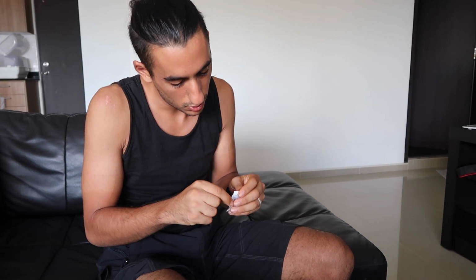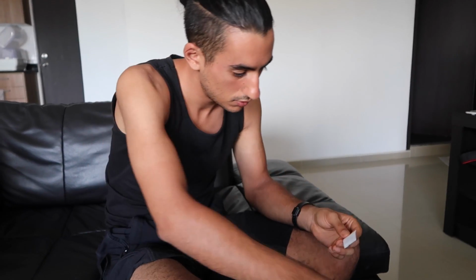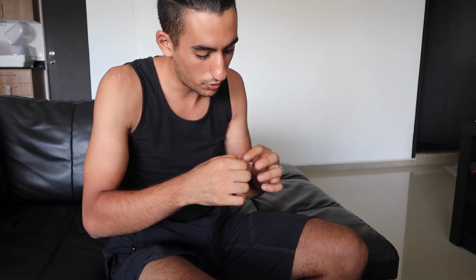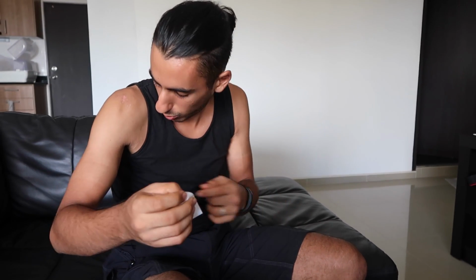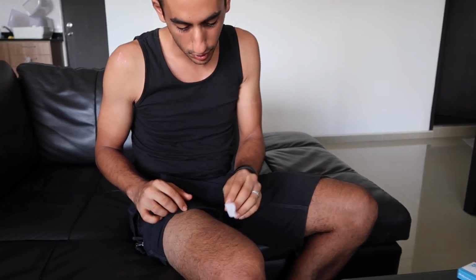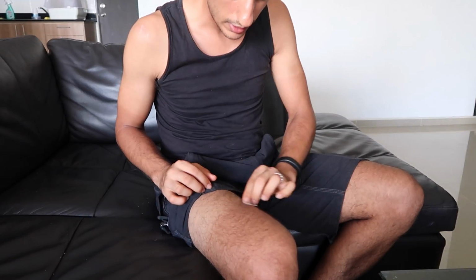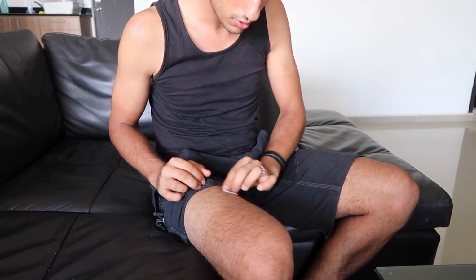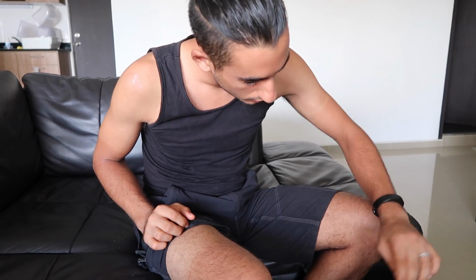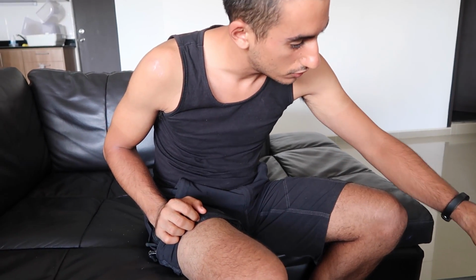So grab this out, clean the area you will inject. With your arm, a little tip, I was told to basically draw a line outwards from the armpit, so you kind of want to do it around here. With your leg, it generally doesn't really matter, there's quite a lot of your leg that you can use. So I'm probably just going to go right here somewhere on my leg. Seems like a good spot. So just give it a little wipe with your alcoholic wipe, and then I'll tidy up the mess I made a little bit earlier.